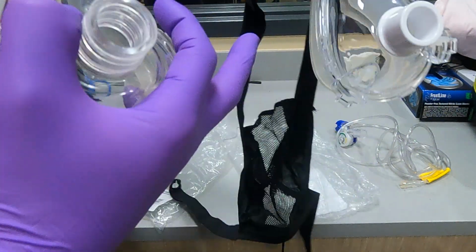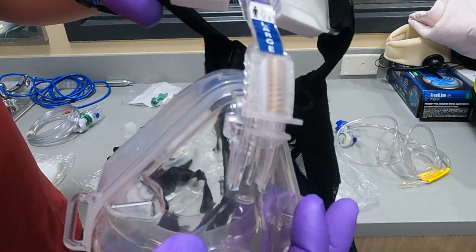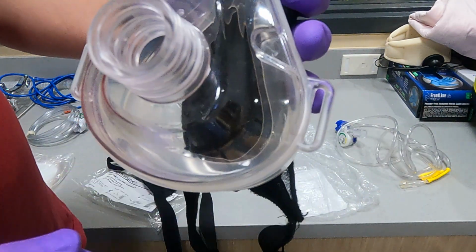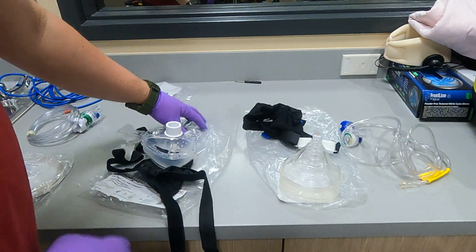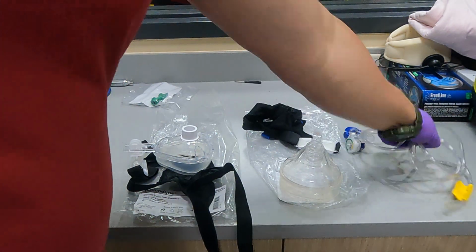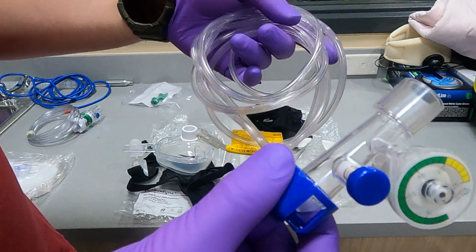They both have a headpiece attached to them. It's attached up at the top on the forehead, and then they connect down here underneath. It'll come underneath the ears to help hold that in place. Where these masks differ is in the tubing. So here's the old one's tubing.